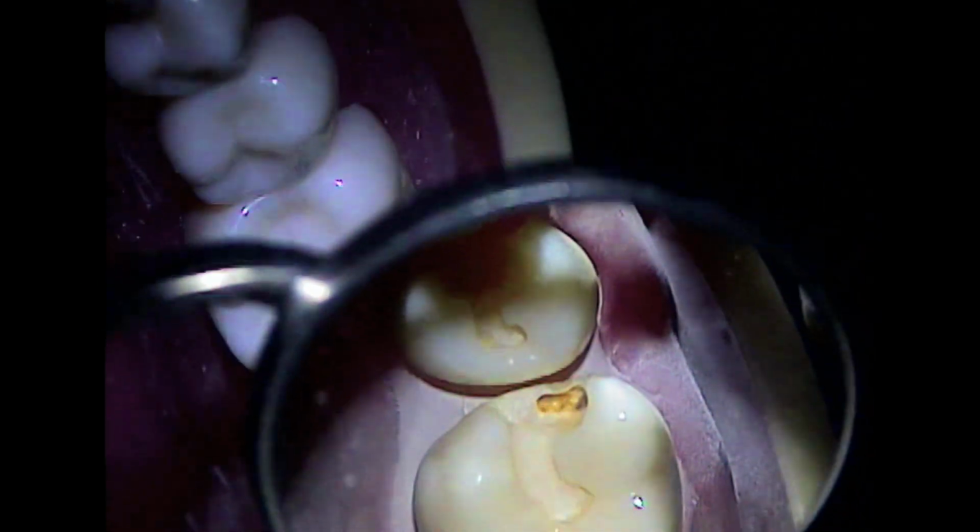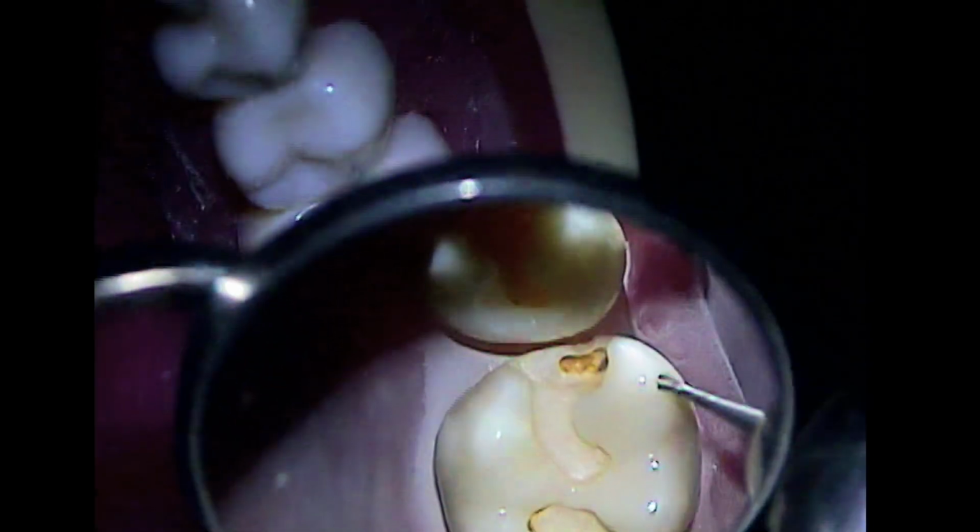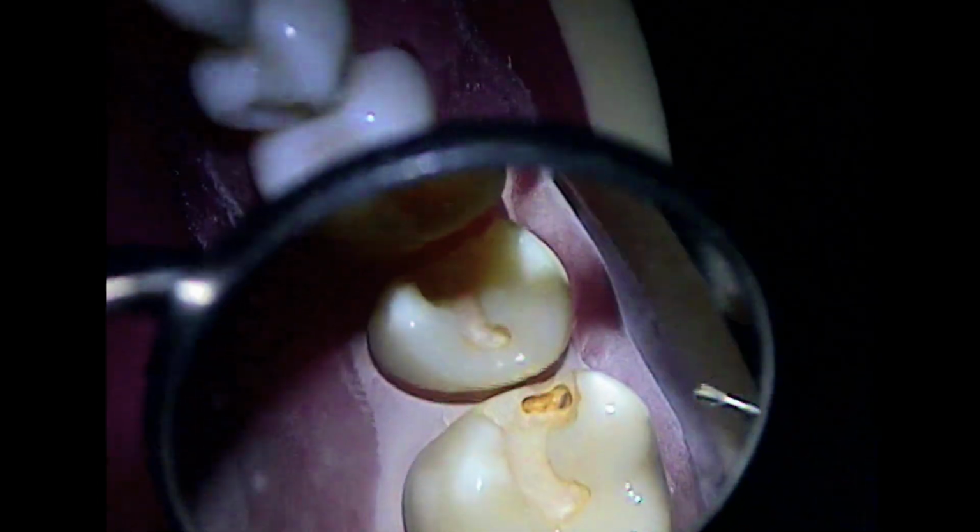Is this a new 330 burr? Yeah, this new one. You did a new one for the DO? Yeah. Okay. I'll do DO once more on the other tooth because I'm not happy with what I have done. One prep, one burr. Then it won't necessarily get so burning like that. But we looked at this one before. Yeah, we did look at that.